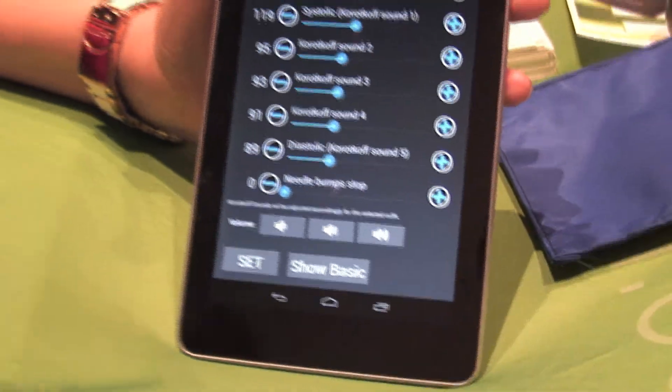So at end of life, when a patient is passing, that needle bumps all the way to the end, though there are no sounds. With this, you're able to duplicate that to help your students get more confidence in what they're hearing and seeing, correlating the two to allow them to really experience it.